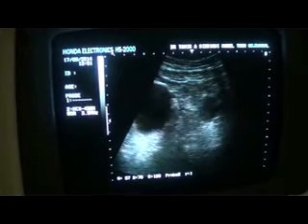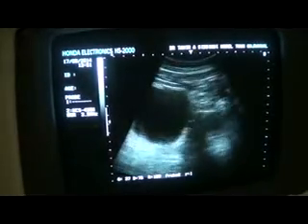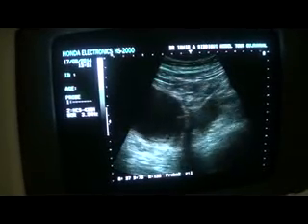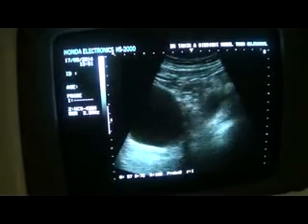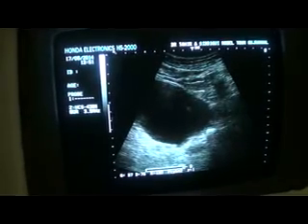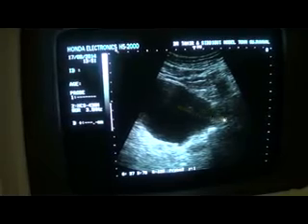This is the urinary bladder, and this rounded structure that you are seeing is the dilated distal ureter. This cystic area is the dilated distal ureter. This is the urinary bladder, and you can see it's opening into the urinary bladder. No calculus is seen throughout the course of the dilated left ureter, and there is no sign of any obstruction in its opening into the urinary bladder. This is the distal ureter entering the urinary bladder, dilated distal ureter, left ureter entering the urinary bladder.